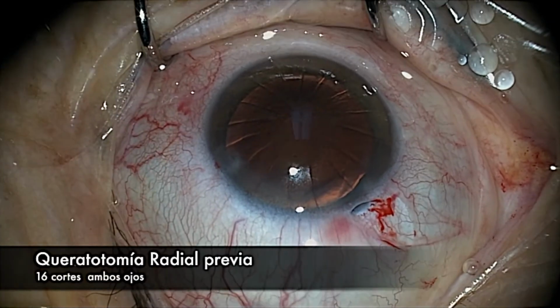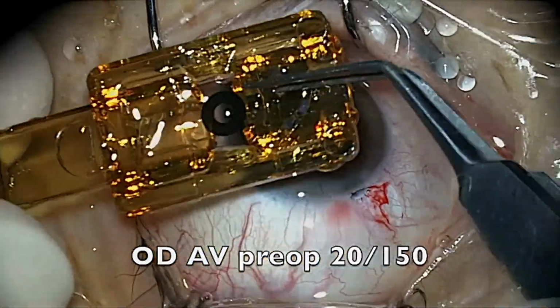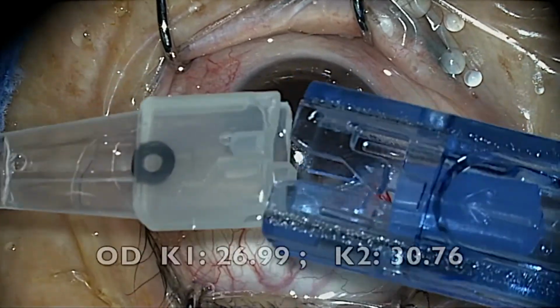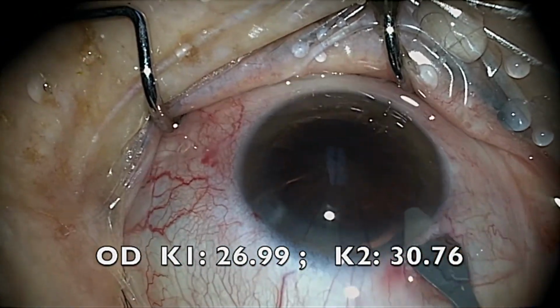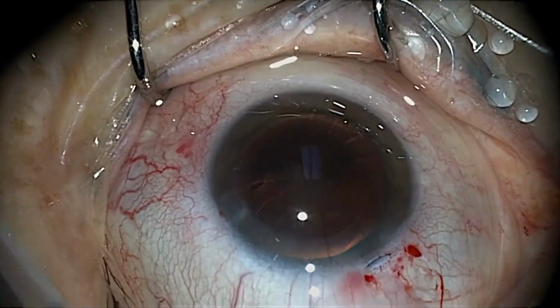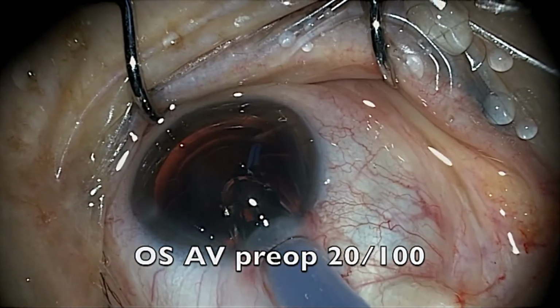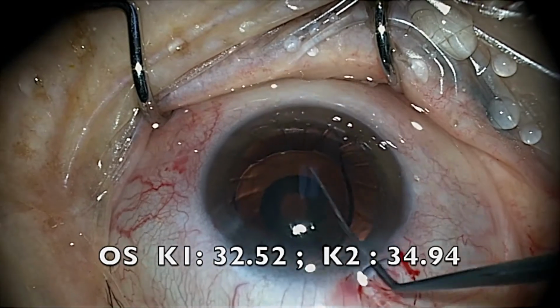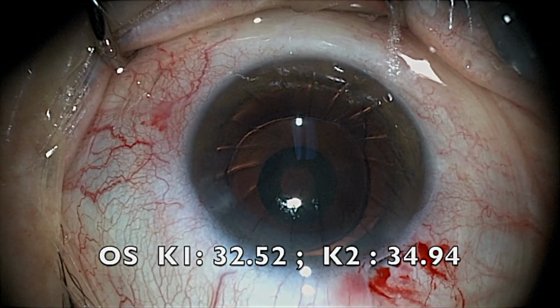This is the case that I just mentioned. You can see that the small aperture IOL goes easily through a 3.2 incision. Once we corroborate that the incision is clear, we insert the IOL in the bag, and it goes in easily, as any other IOL. You can see 16 cuts on that cornea. That makes it very irregular.